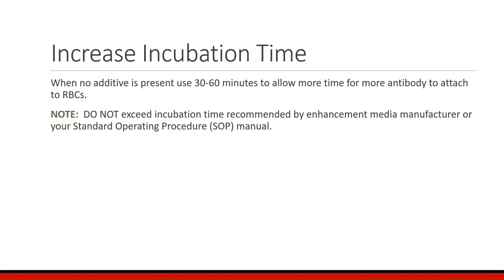Increase the incubation time. When no additive is present, you can use 30 to 60 minutes to allow more time for more antibody to attach to the red cells. And this is used in conjunction with increasing the serum to cell ratio, so you have more antibody and you're allowing more antibody more time to attach to those antigens, and I guarantee you this will increase the strength of reaction by a minimum of 1+.